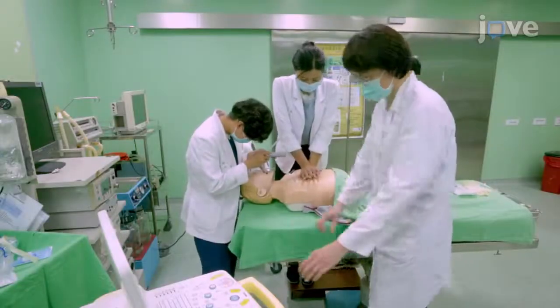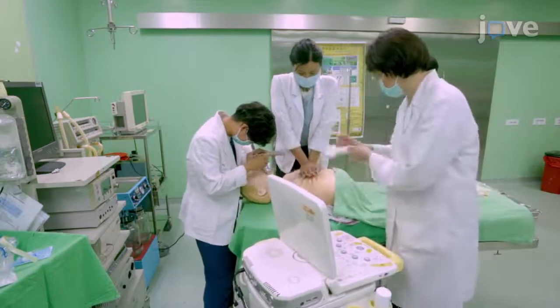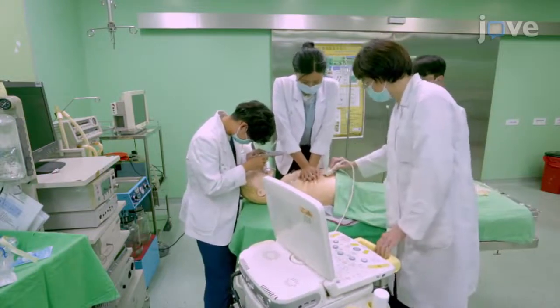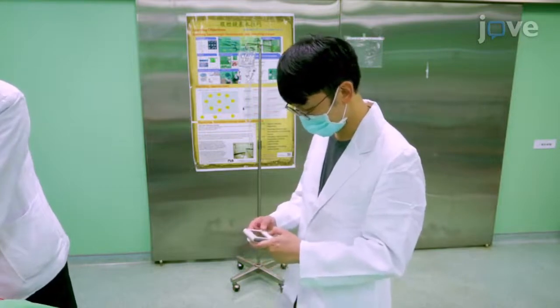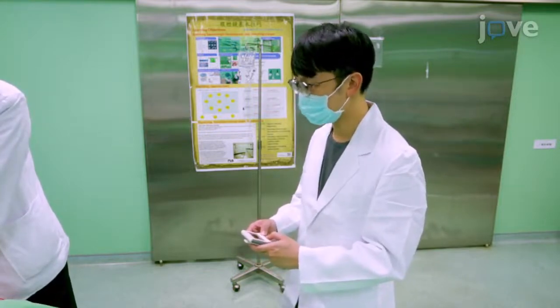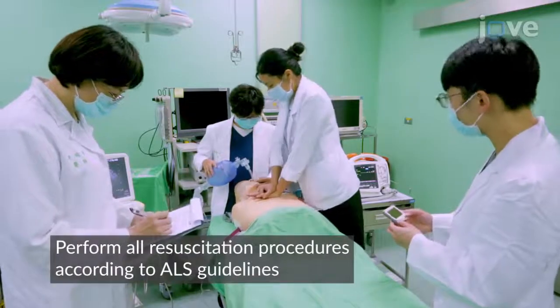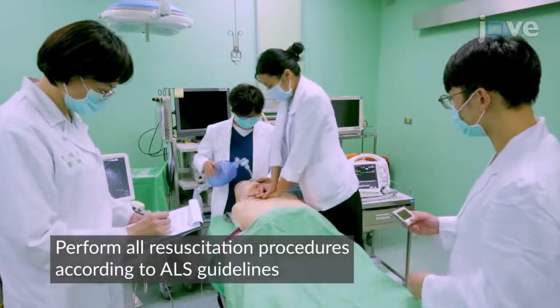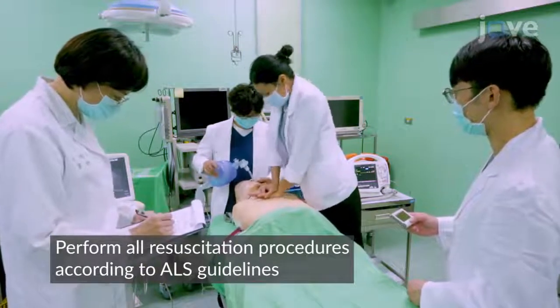When ultrasound is to be integrated into the CPR process, place a portable ultrasound machine in the caudal region of the patient, and set an alarm for every 2 minutes for CPR and every 10 seconds for pulse checks, to restrict the hands-off interval for pulse checks, rhythm analysis and simultaneous ultrasound evaluation to no longer than 10 seconds.